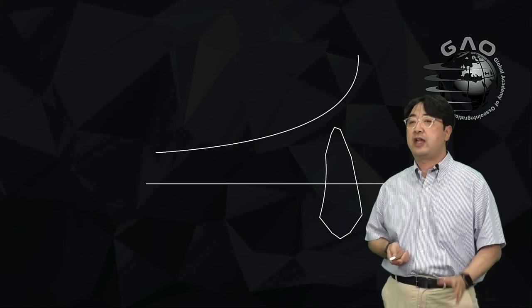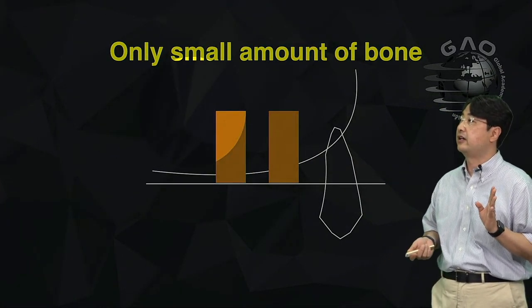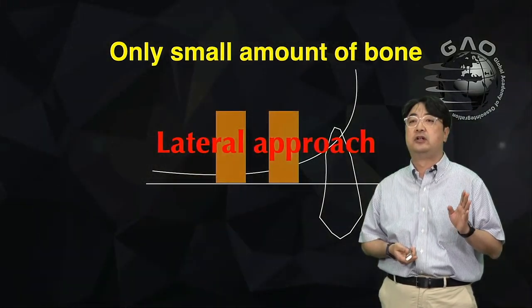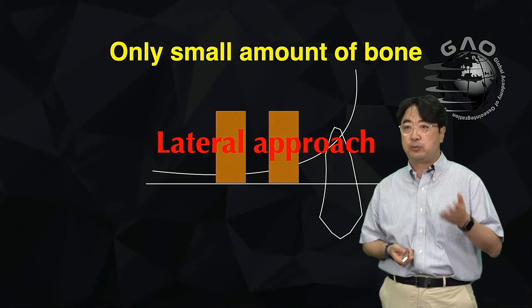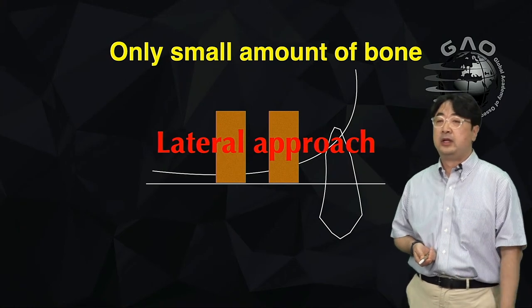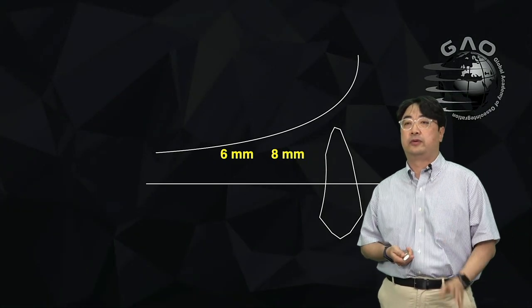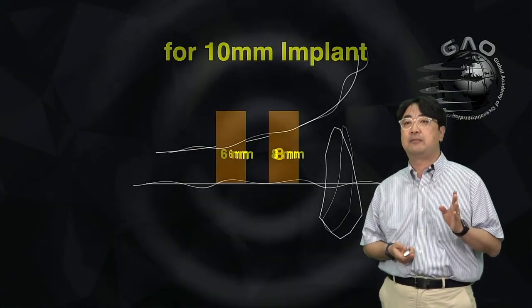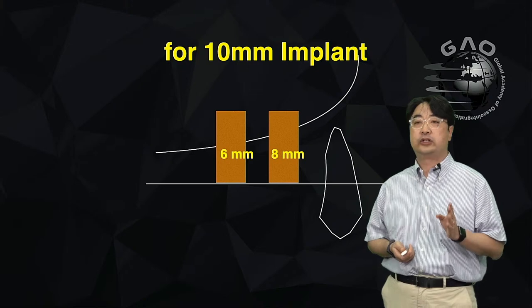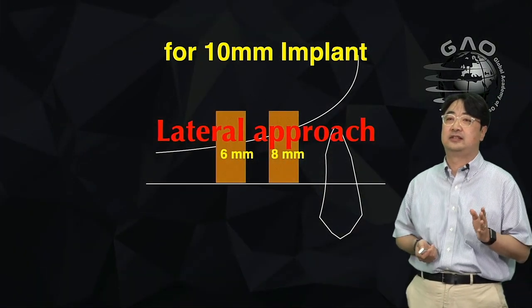Okay, so let me show you the strategy for sinus graft that I have for now. If you have a thin bone, we definitely are going to need the lateral approach for sinus graft for implant placement, either simultaneously or staged, right? But if you have about 6 to 8 millimeter of bone, and you want to place a 10 millimeter implant, what are you going to do? You may need to have a lateral approach for this case, right?